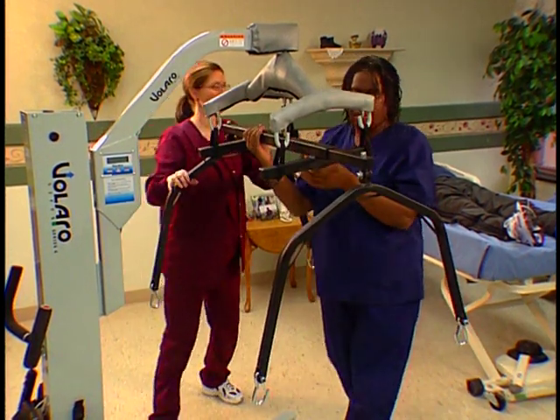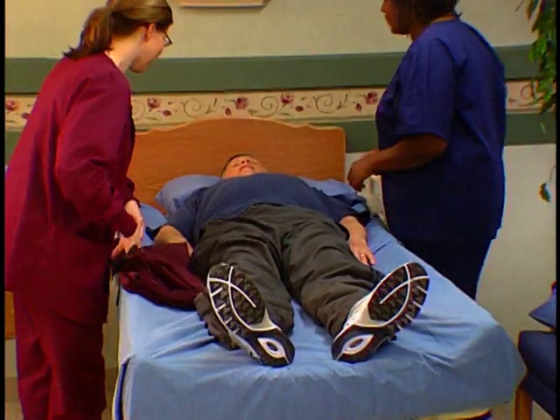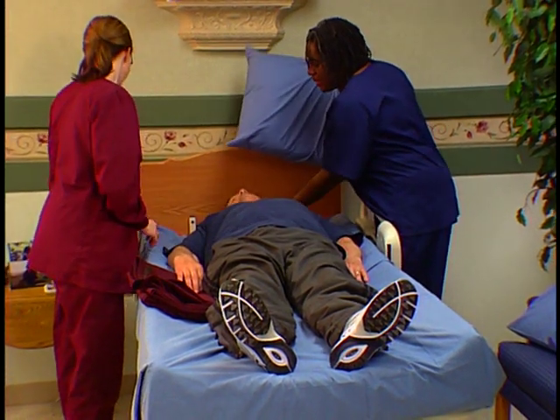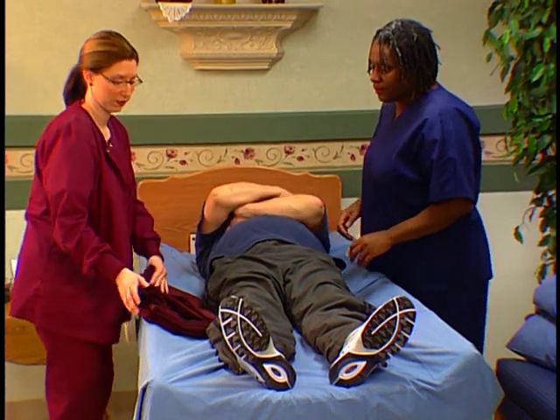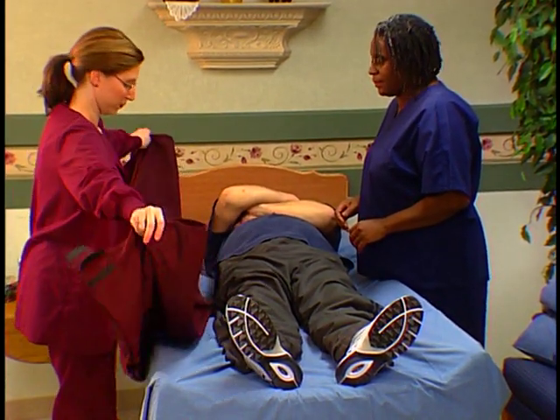Attach the frame loops to the J-hooks on the lift and double-check connections. For safety purposes, observe the stretcher sling you will be using. Inspect the sling loops, strapping, or sling material. If any of these items have cuts, tears, fraying, or loose seams, the sling should not be used.